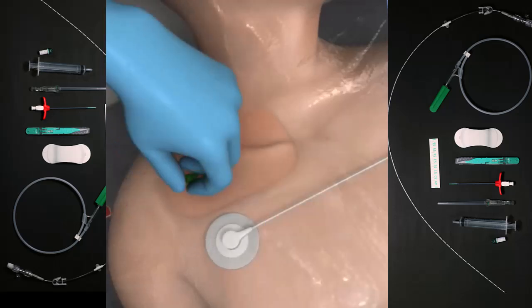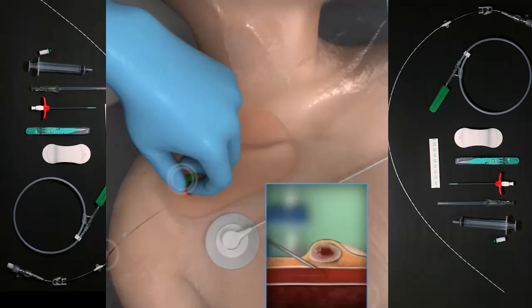When the subclavian vein is accessed, venous blood will flow into the syringe. Swipe to remove the syringe and immediately place your thumb over the needle connector. Confirm venous access by ensuring there is non-pulsatile flow when removing your thumb from the needle temporarily.